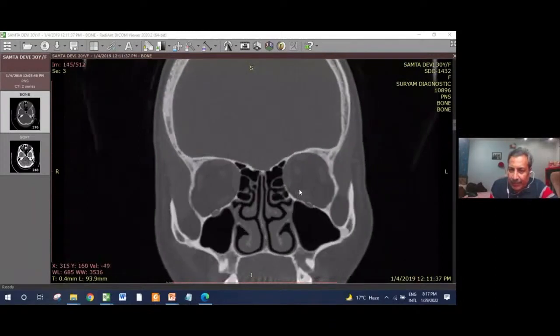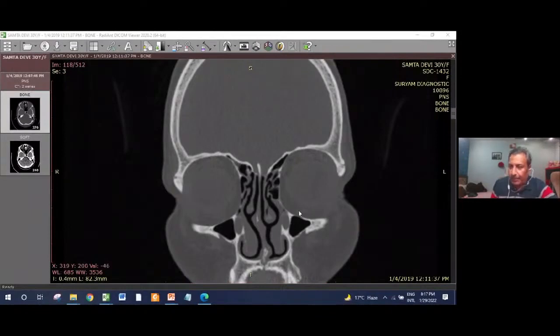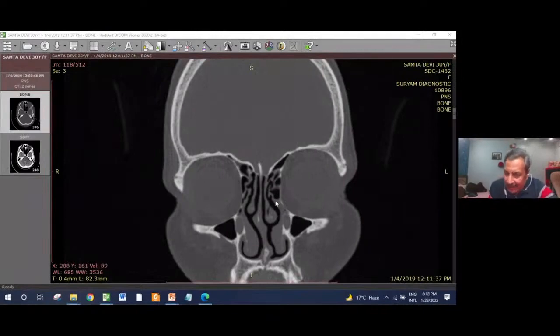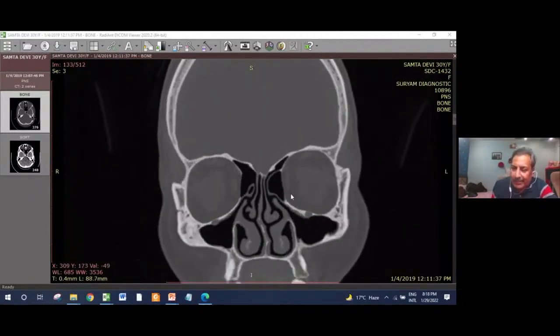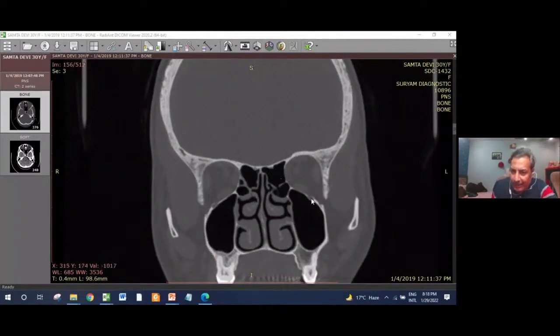And here you have to be careful. Anteriorly there is a lot of pad of fat between the intra-orbital structures and the sinuses. Even if you breach the bone, the fat collapses and protects the important structures, the muscles and other intra-orbital structures. But as you go behind, there is relatively no fat. You have to stay extra careful. The bone is much thinner. If you happen to breach the bone, you can easily damage the medial rectus muscle over here, inferior rectus over here, medial rectus over here.